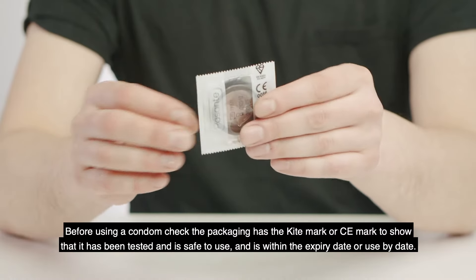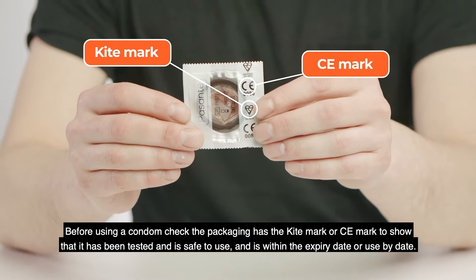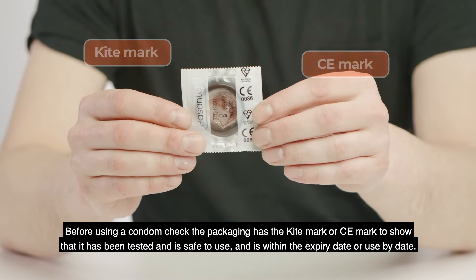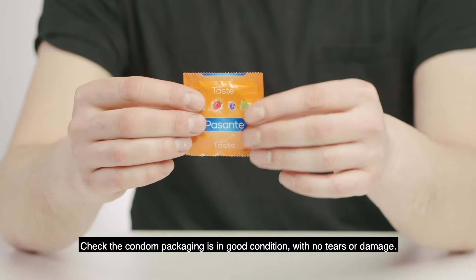Before using a condom, check the packaging has the kite mark or CE mark to show that it's been tested and is safe to use, and is within an expiry date or use-by date. Check the condom package is in good condition with no tears or damage.